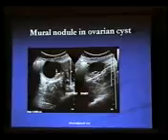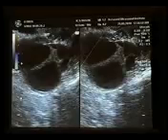Here is an ovarian cyst with a mural nodule here. The mural nodule in the ovary. Another ovarian cyst with nodules, mural nodules. Although the size of the ovarian cyst may not be very large, this is showing a high diastolic blood flow. Ovarian cyst with fleshy masses projecting into the cyst cavity.